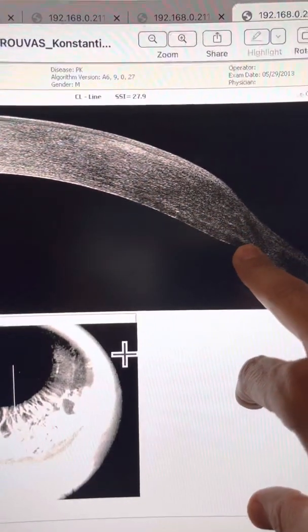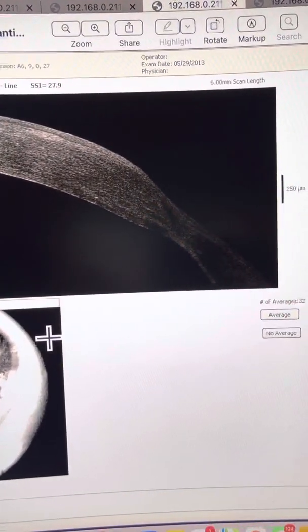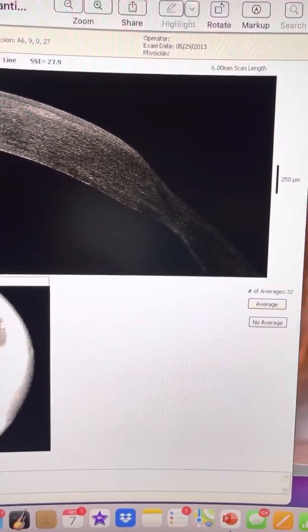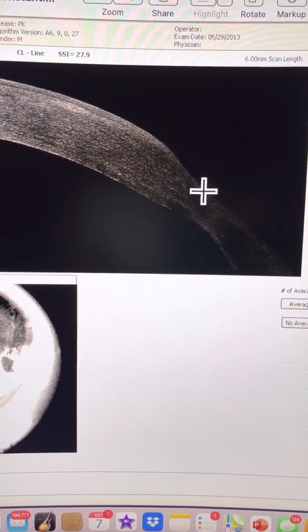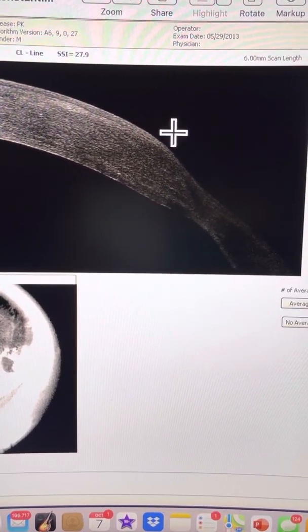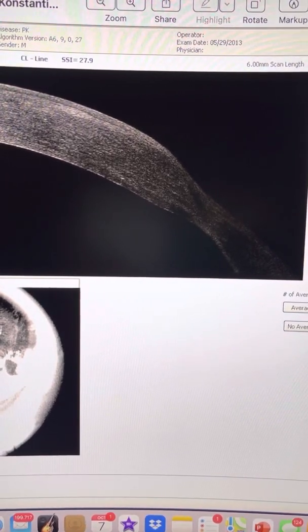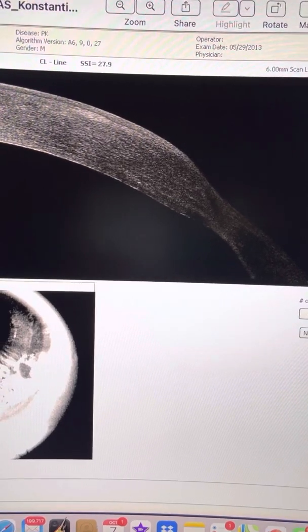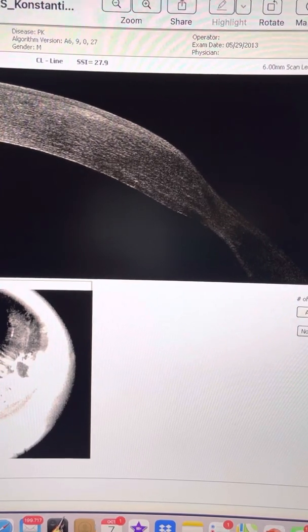The graft looks very good. Good thickness, uniform. But the graft-host interface is very thin. Remember, keratoconic patients keep rubbing their eyes. So what we proposed here was to open the incision as deep as we could, resuture the cornea, and treat with an annular cornea cross-linking treatment in order to bring the cornea back into its original graft-host interface position.